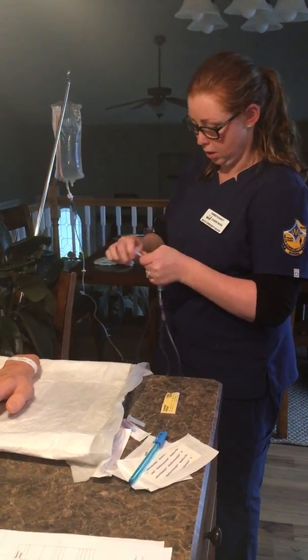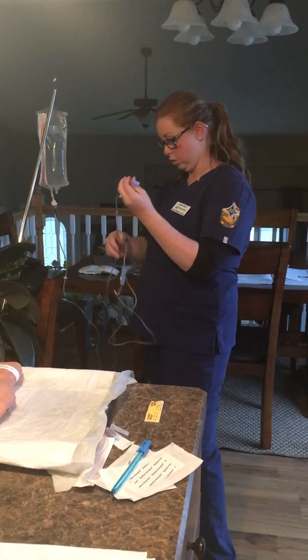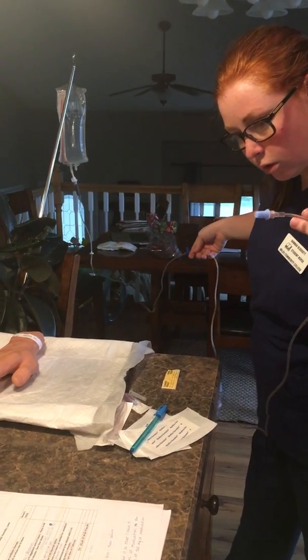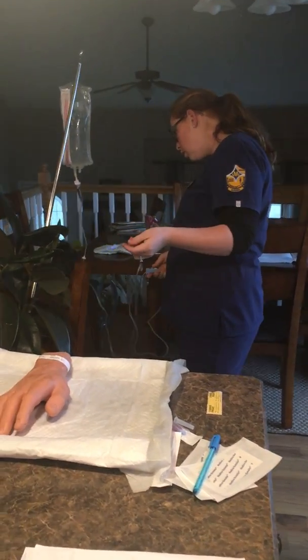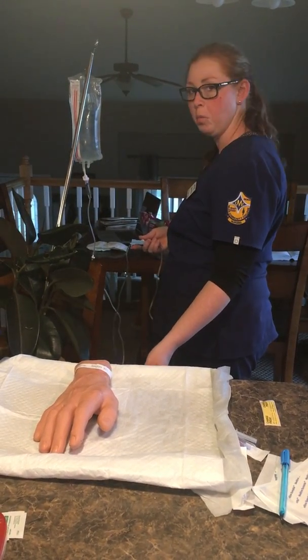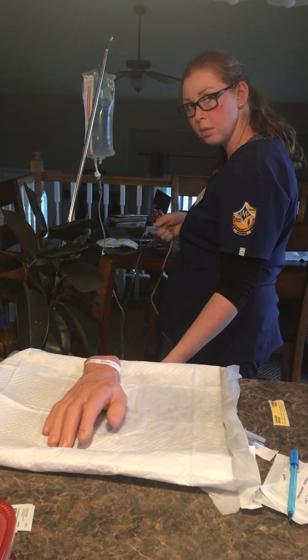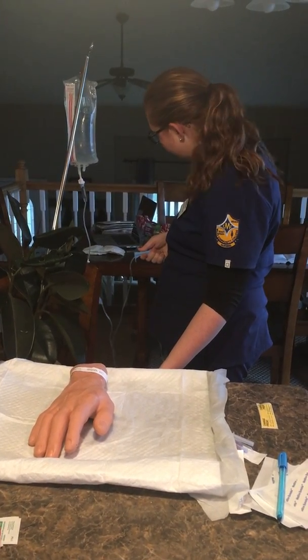Okay. So I've already calculated my drop factor. And so at this time I could go ahead and set my drop factor on my tubing if I wanted to. Which I think we calculated at 7 drops every 15 seconds. So I can go ahead and do that. I'm gonna use a timer or a clock, put the second sign on it. My nurse friend over there is gonna tell me when 15 seconds is up or when to start. Go ahead.